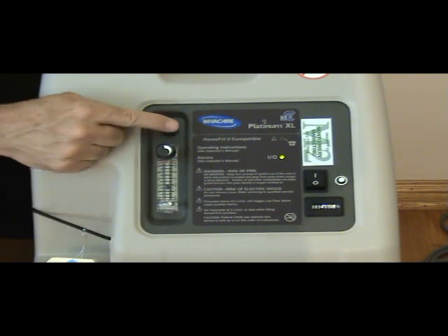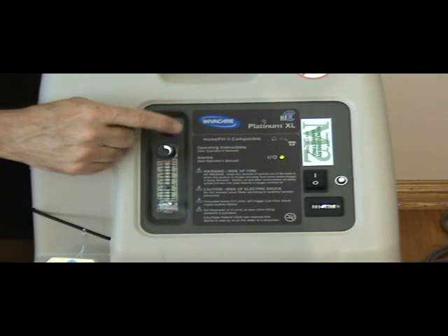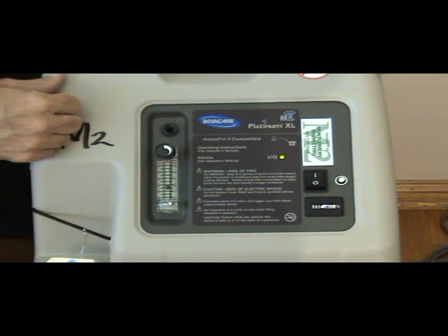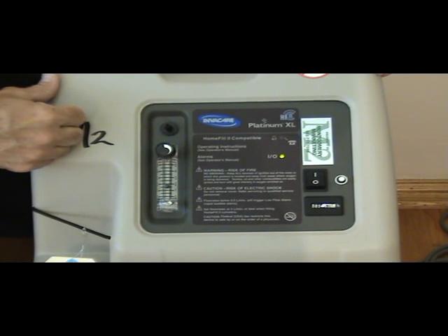The oxygen actually comes out right here. As you can see, as I cover it, the ball goes down in the meter. This is where the oxygen comes out, so this is where you need to hook up your connections, which is the next thing that we're going to go over. So as we proceed from here, we will now go over the connections to the patient and the tubing that goes along with it.